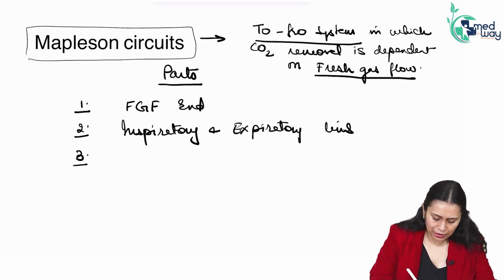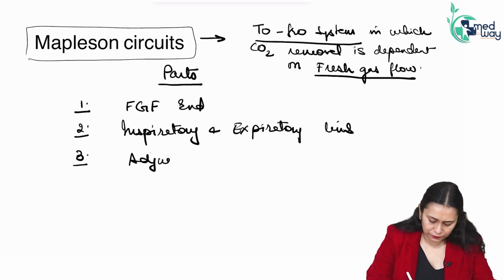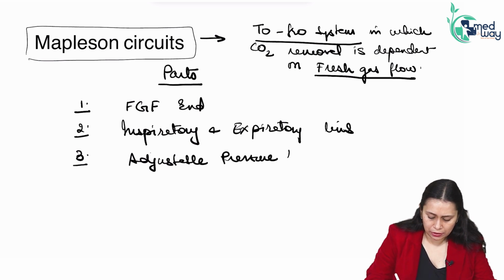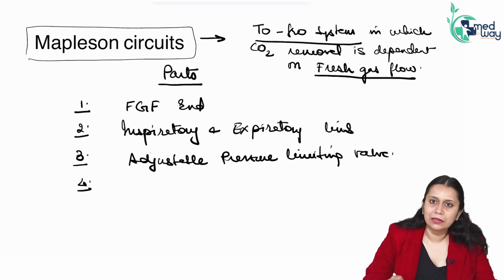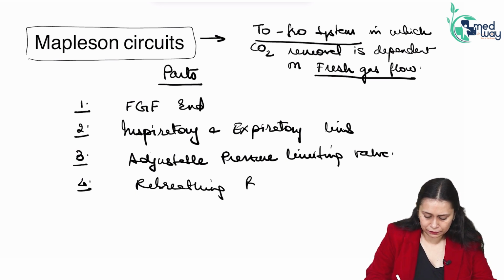Then it has the adjustable pressure limiting valve, and it has the rebreathing bag, and it has the patient end.